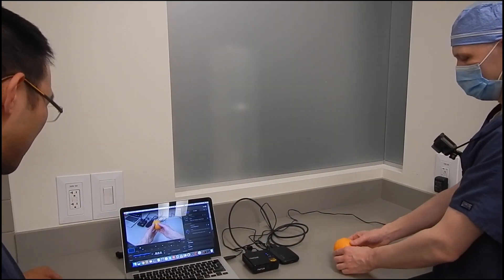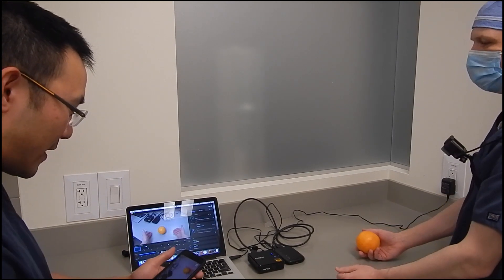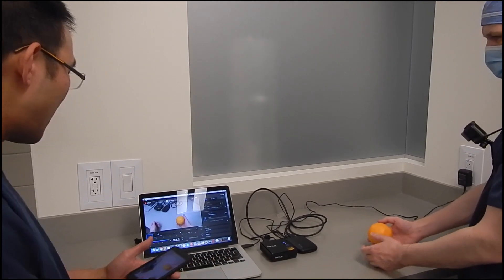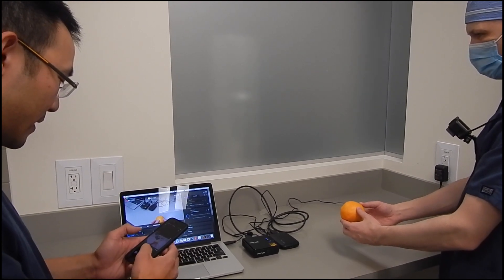Now one can observe the complete system in action. With the surgeon's kit wirelessly transmitting the HD video feed, this can be viewed on as many LED panels as desired in real time.